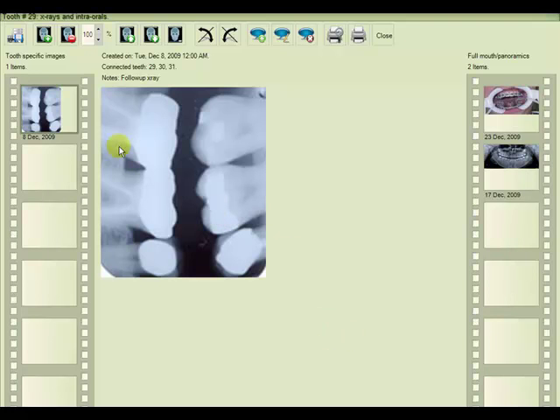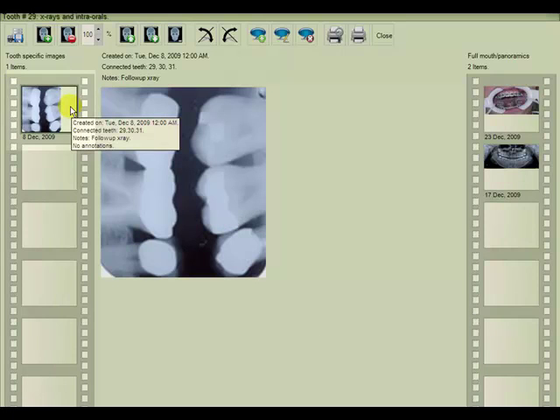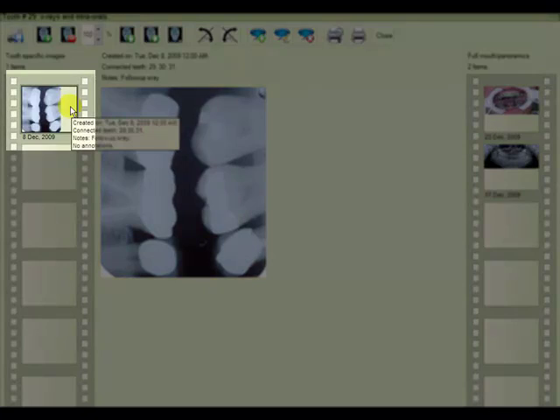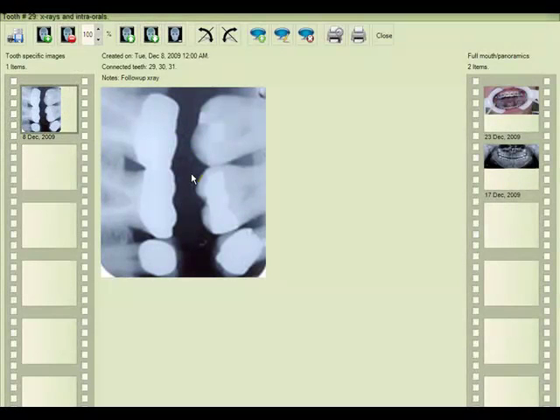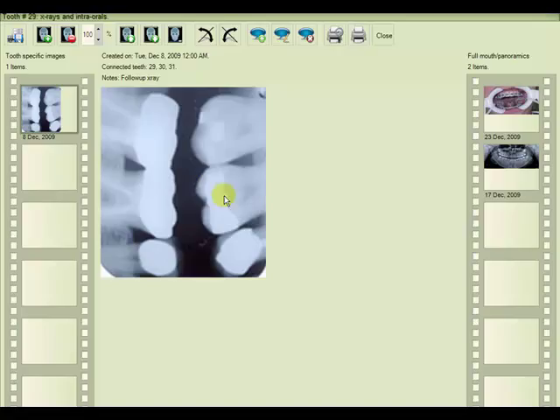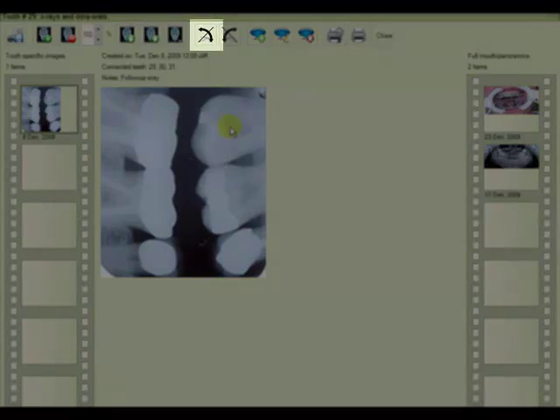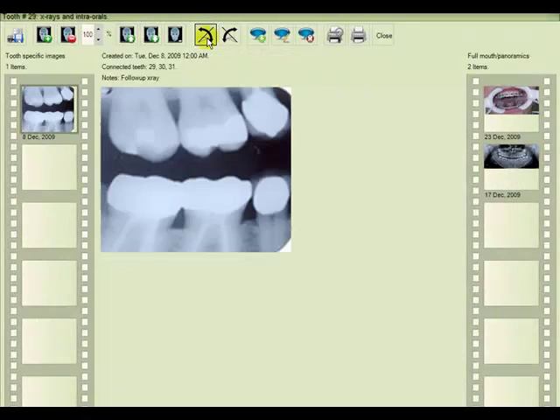And the imported image is seen on the film strip here. If the image was scanned incorrectly, as we see this one was, we could also rotate the image into its proper orientation.